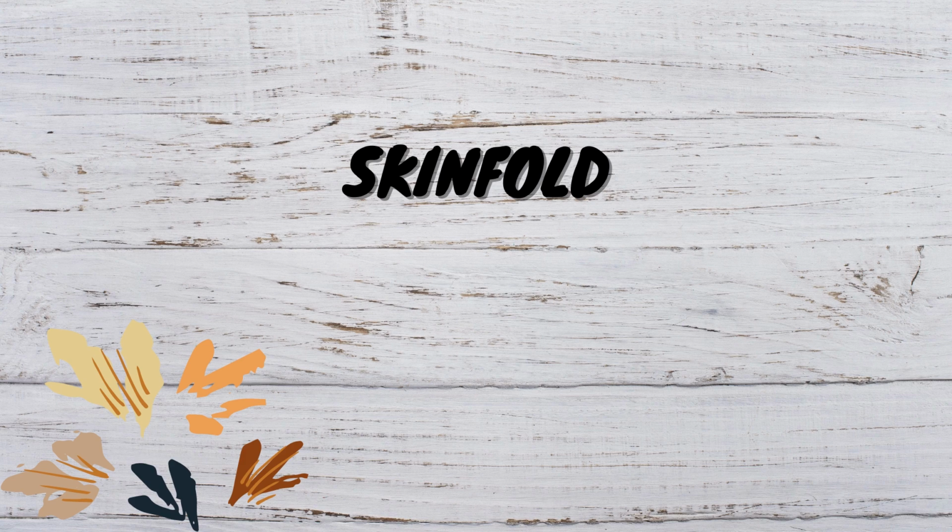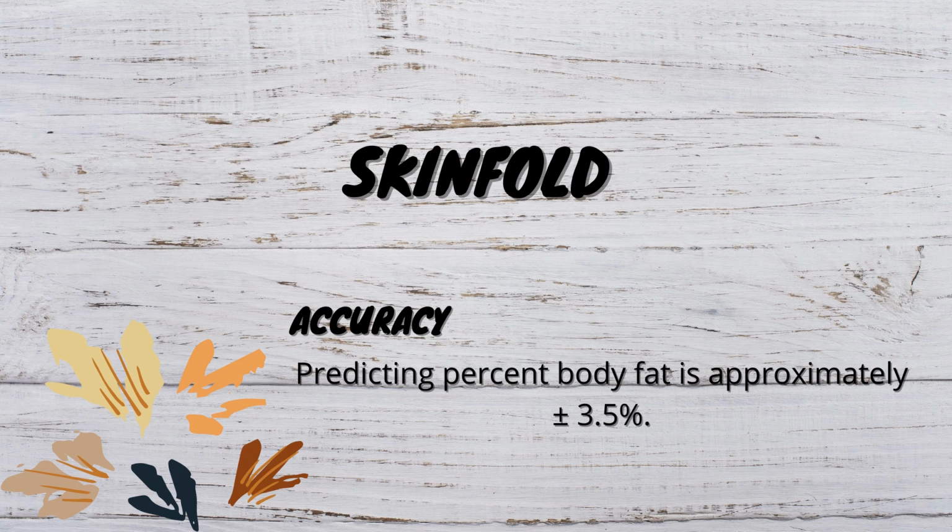Skinfold. The purpose of the skinfold is to determine the body fat levels with the measurement of the skinfold thickness. The principle behind skinfolds is that the amount of subcutaneous fat is proportional to the total amount of body fat. One third of fat is located subcutaneously, but the exact proportion of fat varies with sex, race, and age.